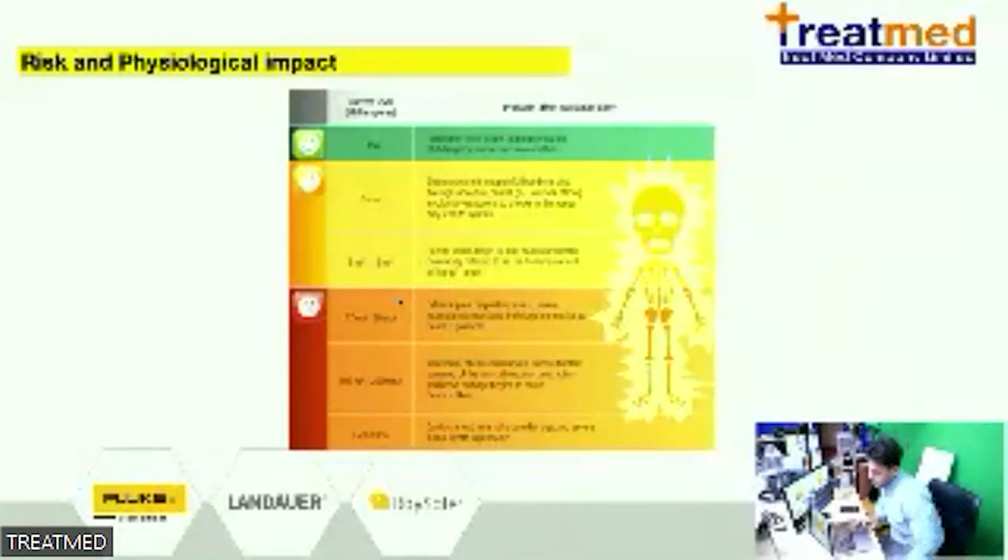Then 17 milliamp to more than 2000 milliamp is extremely dangerous for the leakage current of the medical device. This can cause extreme pain, respiratory arrest, death, and fibrillation. This happens from the higher current.